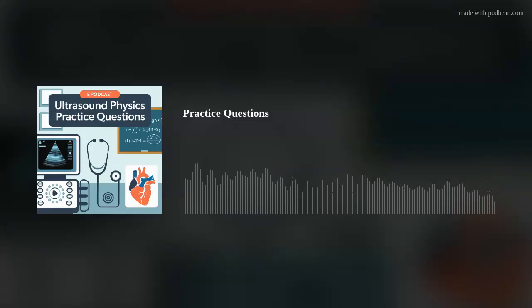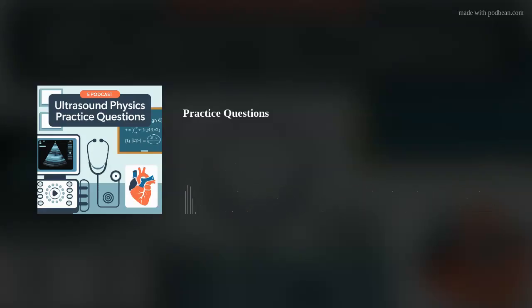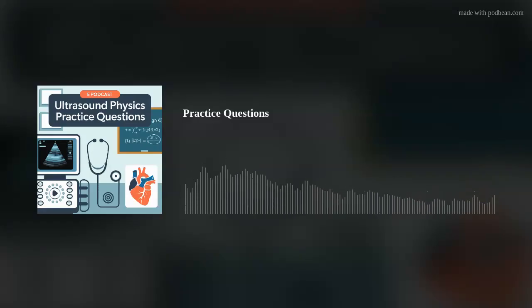This one asks about what happens when an ultrasound beam hits an interface at a perpendicular angle. What's so special about that? When the ultrasound beam hits straight on, or at a 90-degree angle, there's no refraction. Remember, refraction is the bending of the sound waves as they pass from one material to another. So it's like a special case where those sound waves don't get redirected.